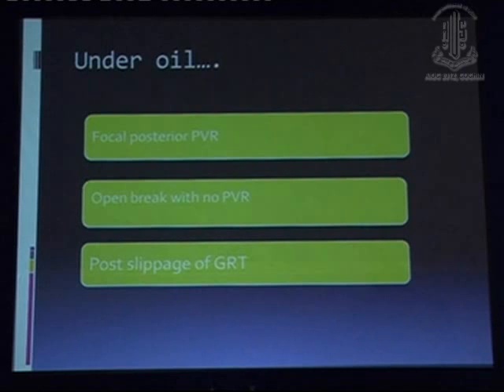So under oil surgery can be done in a few selected cases like focal posterior PVR, single open breaks in the periphery with no PVR changes, and posterior slippage of the GRT.